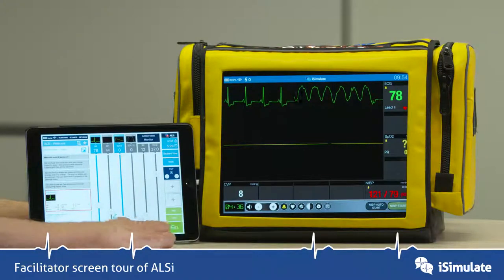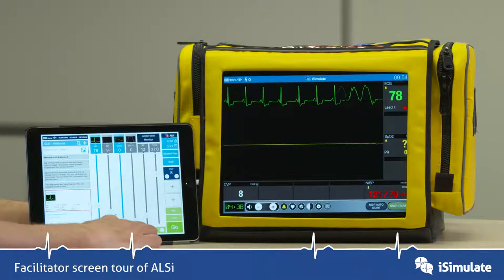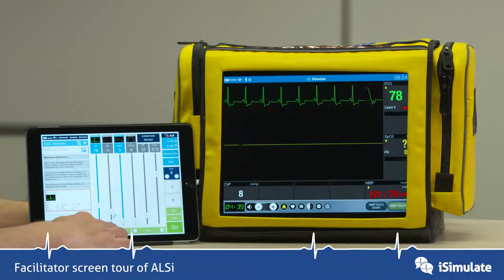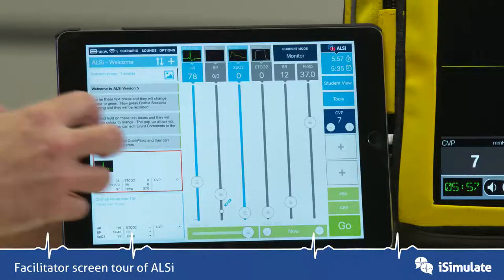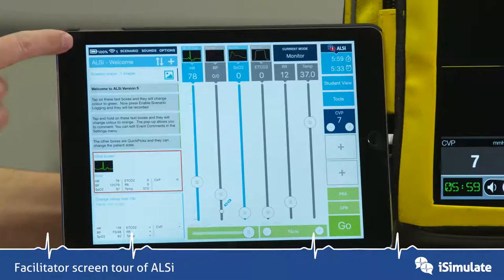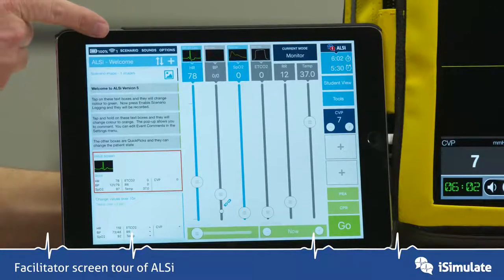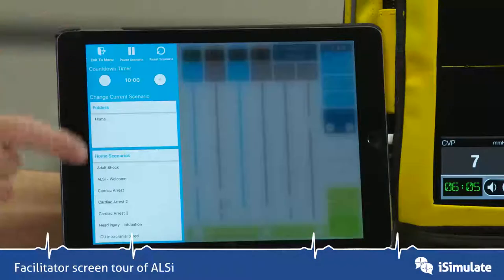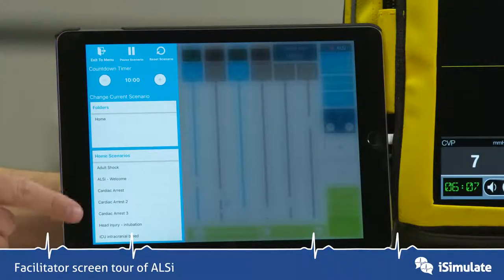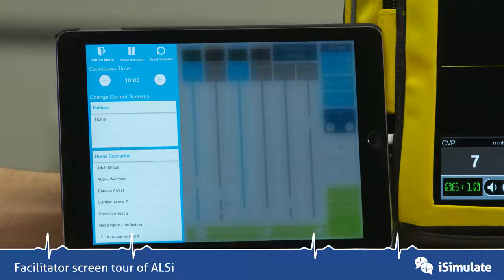We've already looked at the trend buttons, and we've also got virtual time to speed through time — for instance if you were doing two minutes of CPR and wanted to move through it quickly. Coming back to the top, there's a battery indicator, a Wi-Fi connected indicator, and the scenario button which shows you all the options for changing scenarios, exiting to the menu, pausing, and resetting them.